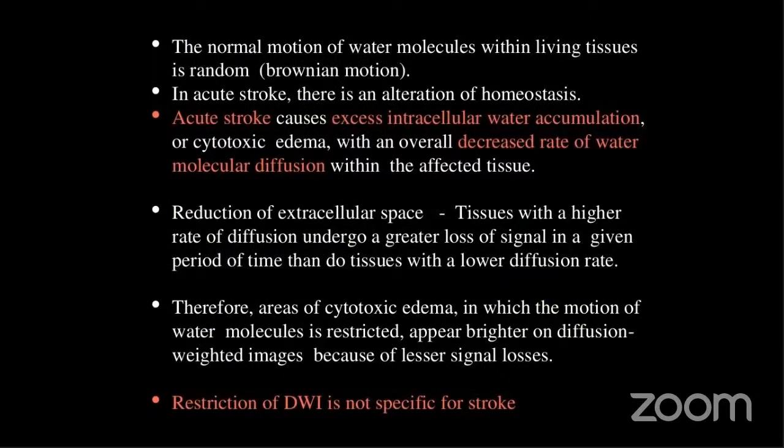The changes in diffusion weighted images are said to be seen as early as around 2 hours, or at least before 6 hours. As early as 2 hours you can start seeing changes in diffusion weighted imaging, so you can pick it up at the earliest. Then you need to know this: FLAIR is said to take more than 6 hours. Whereas in diffusion, it takes 2.